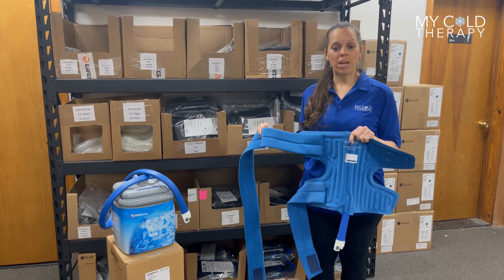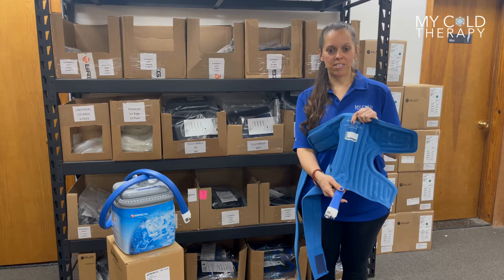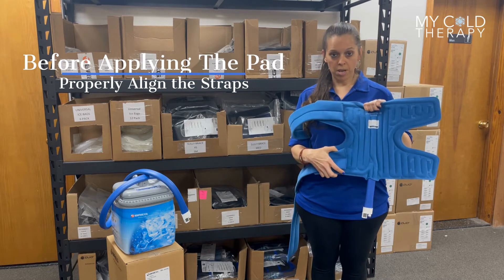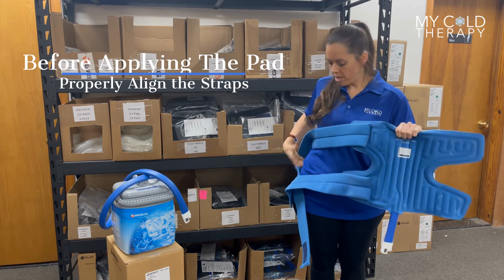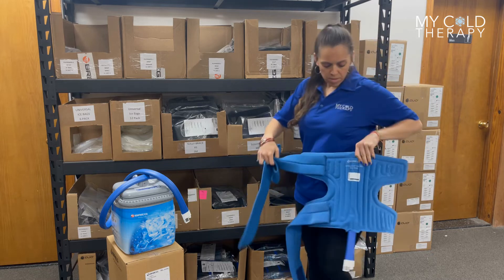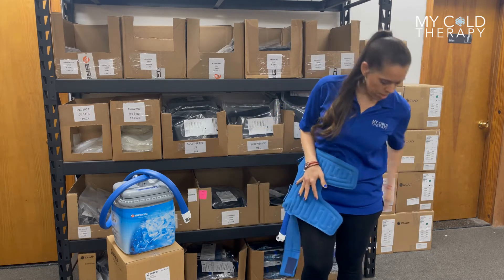To apply the Bregg PolarCare Kodiak Hip Pad, first make sure your hose is facing downward. This pad comes with two straps: the shorter strap is going to connect to the bottom of the pad, and the longer strap connects to the top of the pad. It doesn't matter which hip you're treating — you can start with the right or the left, depending on which one you're going to be doing.